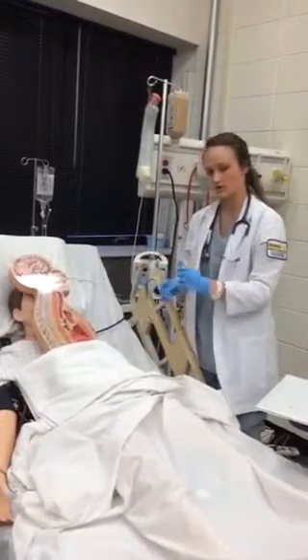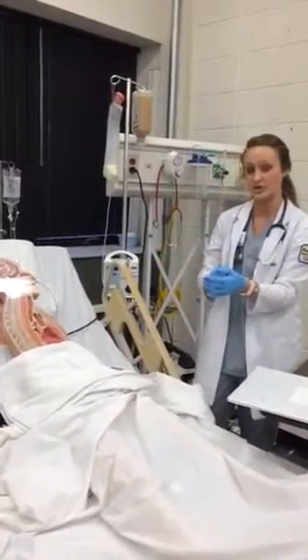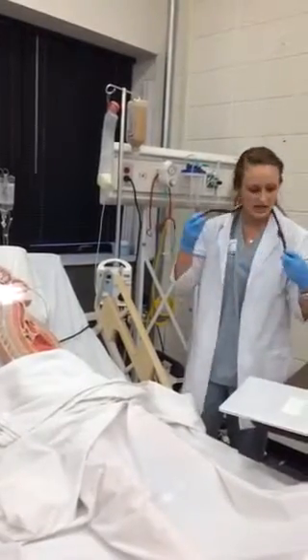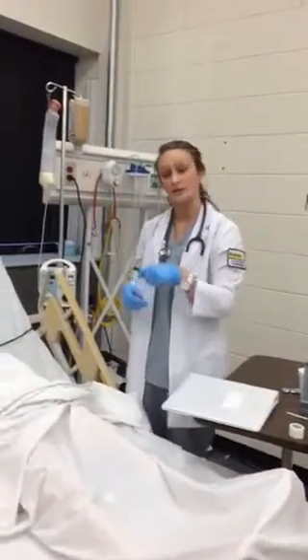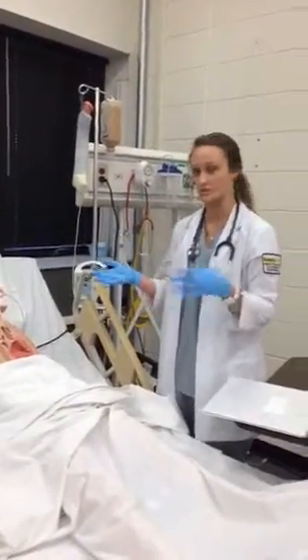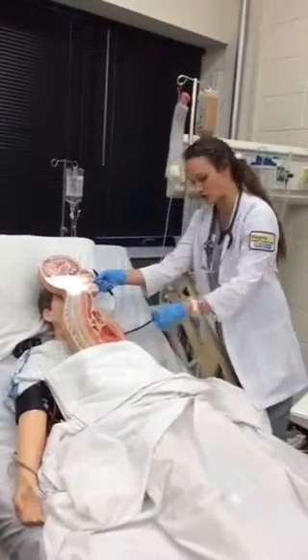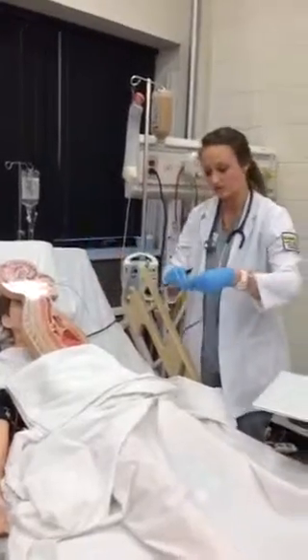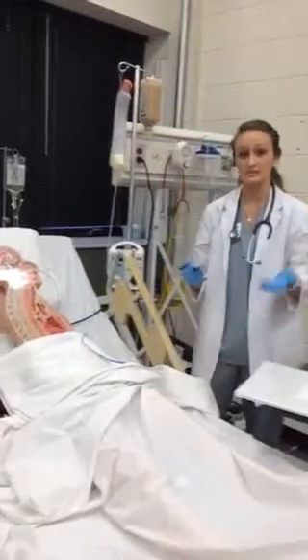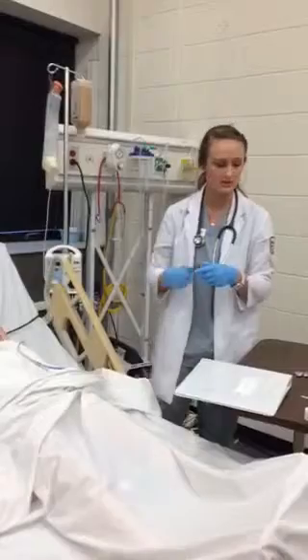Whenever I clamped this so nothing comes out, and the placement was confirmed by the pH, we would send them to x-ray just to get a more confirmed placement. And then whenever they get back from x-ray, we will mark the tubing again just so that we know it's in the right place since we didn't see them. So you would, again, check this. You would measure how much of the tube is left, and then you would document that. And you also want to make sure that you never reposition an NG tube if they had gastric surgery, because you don't want to damage anything.